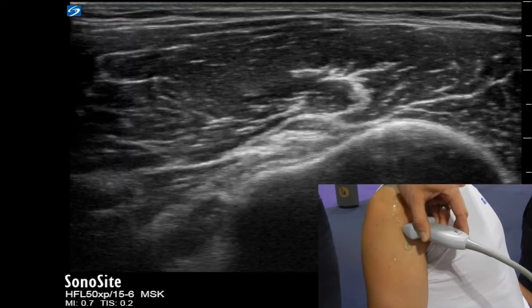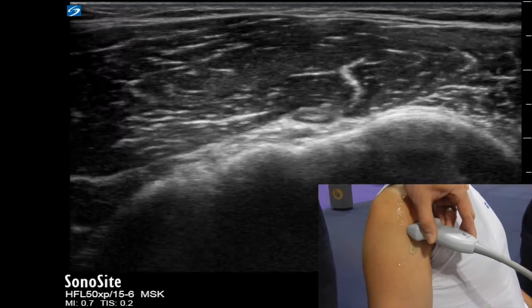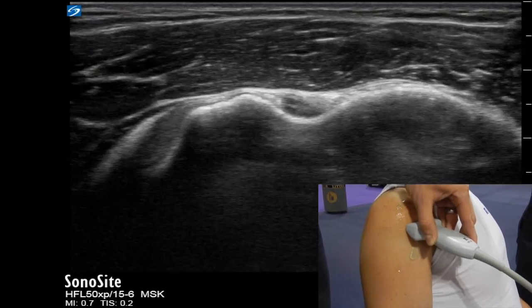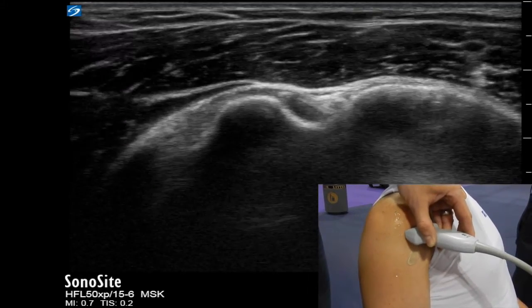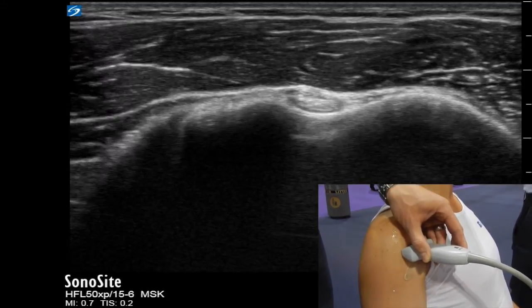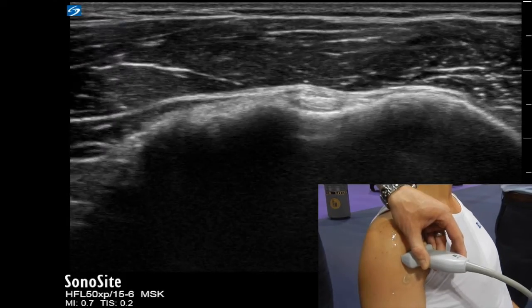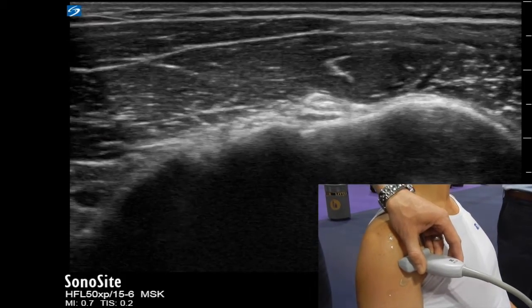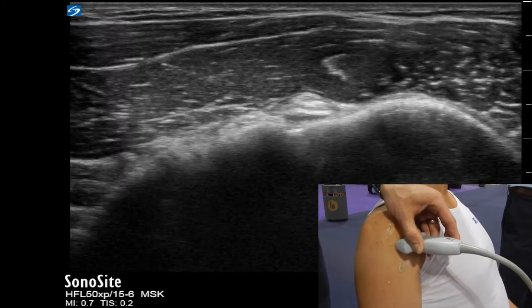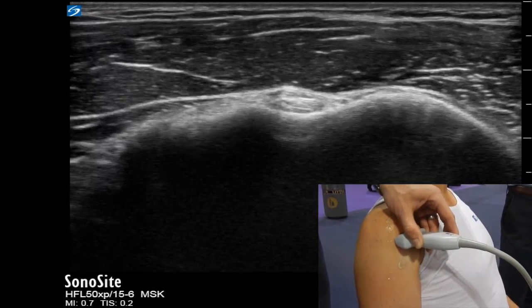It's an excellent area to practice your probe skills on, following the tendon, keeping it centered within the middle of the screen and keeping the bicipital groove nice and level when you come up to the more proximal portion of the biceps tendon.